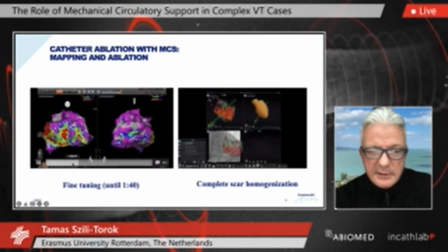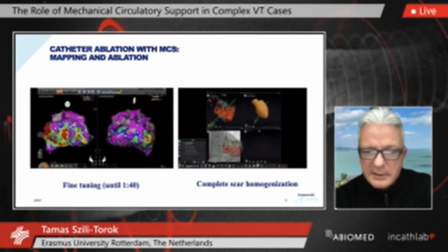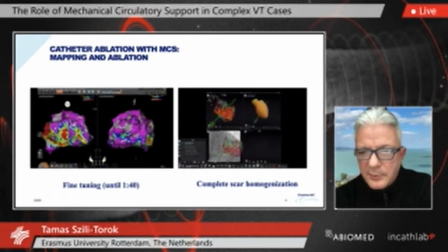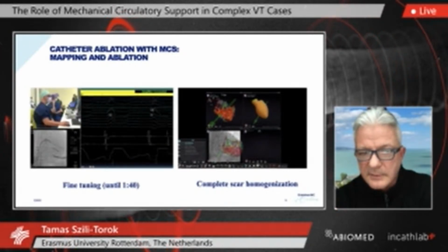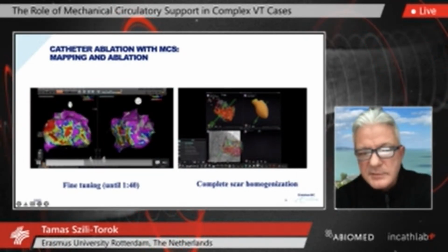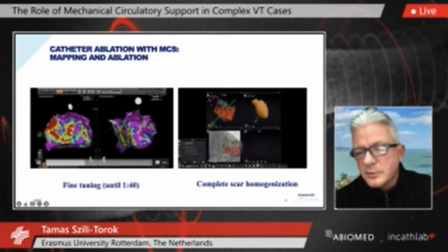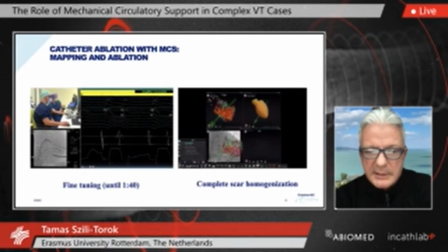I would call it a reach, because you saw this initial image, and now I fine-tuned the map with a robotic catheter, and what you can see at places where we thought using the Pentaray that there is a scar, I can obviously reach. I have a better reach for different parts of the left ventricle, and you see that in terms of size, it became much smaller. Actually, this guy has a much smaller scar than we thought at the beginning.